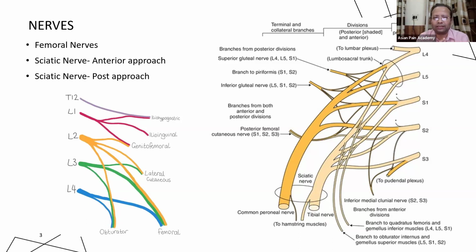So for sciatic nerve block, we use different blocks as such. I will say that it is not a chronic pain procedure as such, but we should know where the sciatic nerve is. At least during our chronic pain procedures, we should not be damaging this nerve.